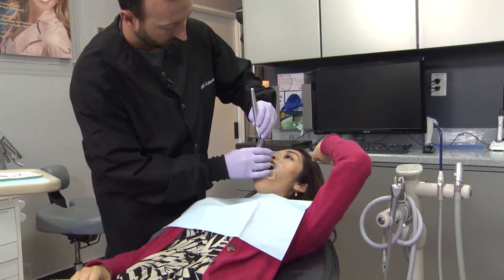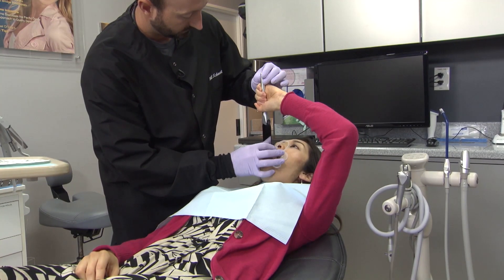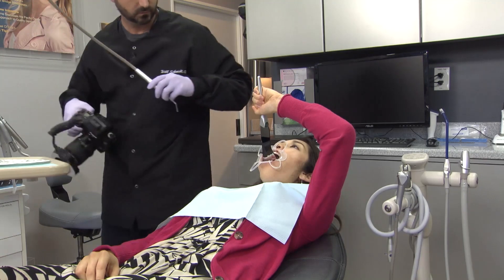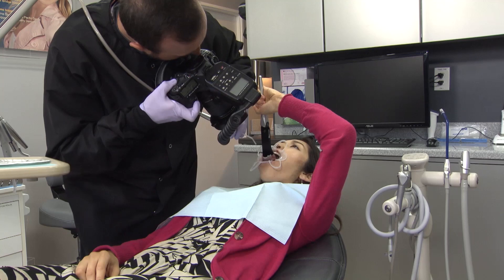If the patient is the only person in the room who can assist you in taking your photos, I like to ask them to hold their arm up at a 90 degree angle as shown here and then grasp the mirror handle with a strong fist. This allows you to photograph without any obstruction and enables the patient to hold the mirror firmly to retract the tongue or tissue.